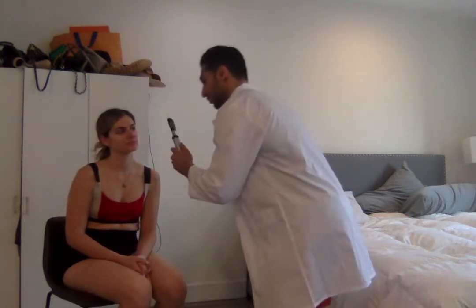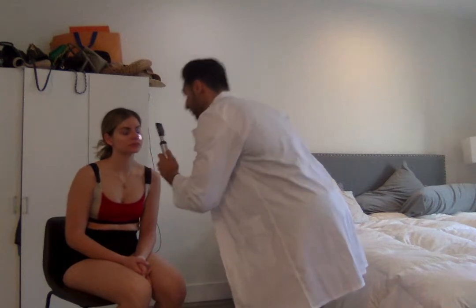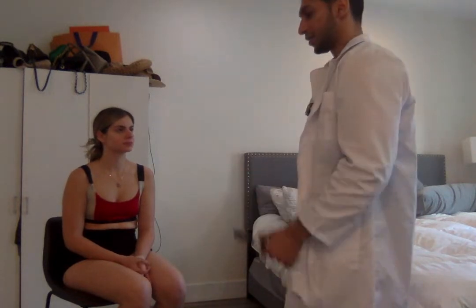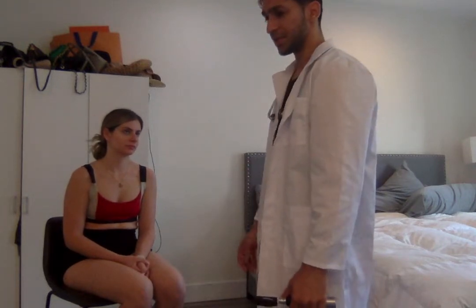Okay. I'm going to look straight ahead. Okay, so red eye reflex is there. I didn't find any opacities. Retinal vessels are intact. The macula fovea are visible. Cup to disc ratio is about 0.3, and disc margins are sharp.